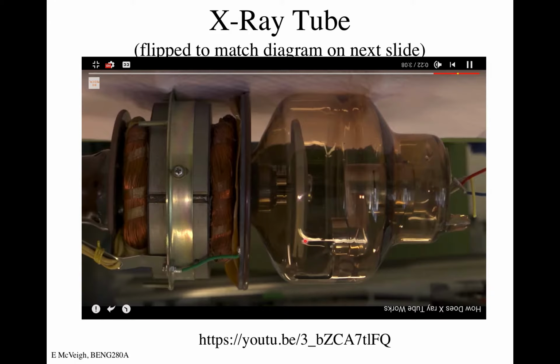The electrons do. Okay? If this was stationary, you could do that for about 10 seconds, and then you just blow it. You burn a hole in the anode, right, with the current that we're talking about here. So what they do is they spin this anode around so that the target is continuously changing and being cooled. And it's being cooled through basically conduction this way.